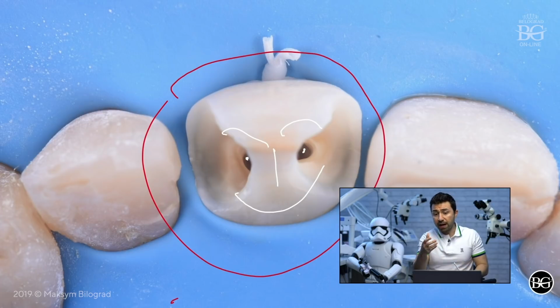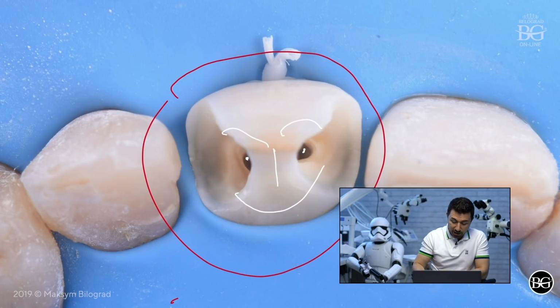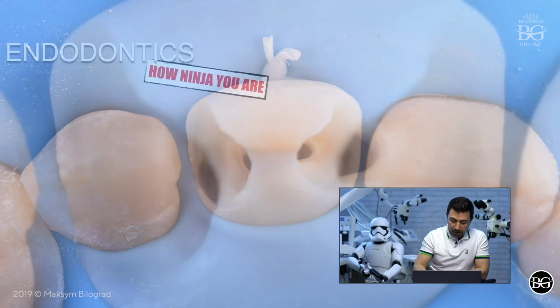And considering the fact that we will be using metal-free ceramic restoration, we can do a really conservative preparation as well, like 0.3, 0.5 millimeters only, and you can keep enamel around and everything will be bonded. So you don't need to make some aggressive treatment just for tooth reinforcement by the post or whatever.